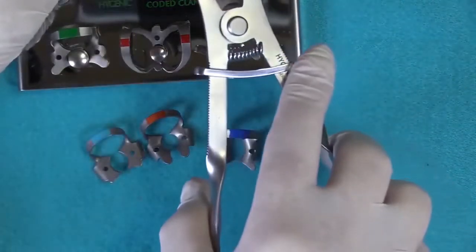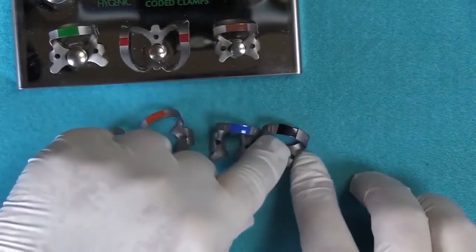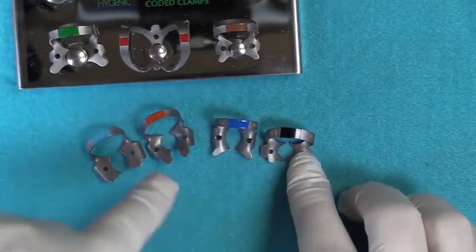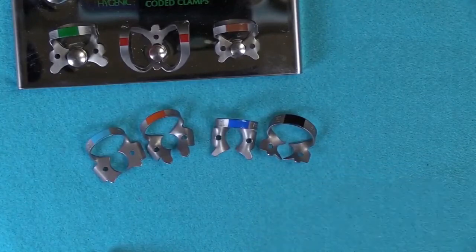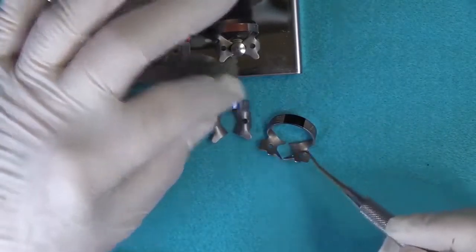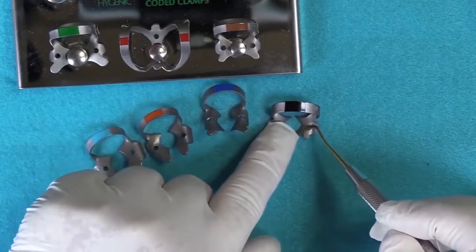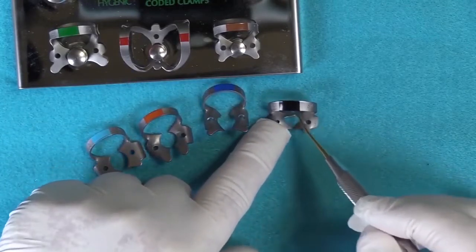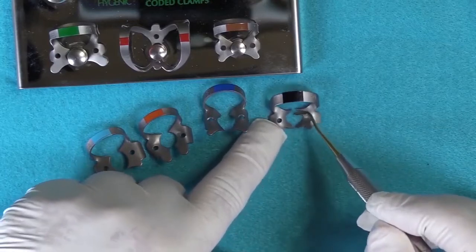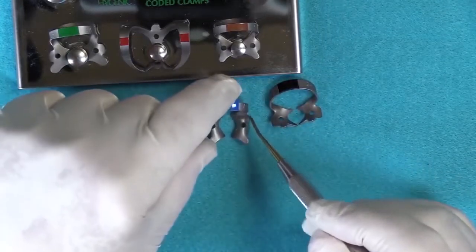The other thing you want to consider is the size of the tooth. For example, if you notice your 8A versus your 14A, can you see the difference in the size of the clamp? By that, I mean if you look at the points of the jaws from mesial to distal, from here to here, if you have a smaller tooth, obviously your four-point contact is going to be located at a point where the distance is less than if it was a larger tooth. You see what I'm saying?